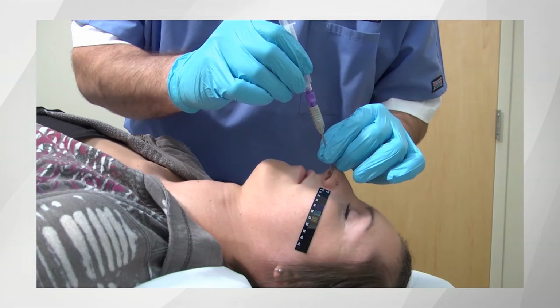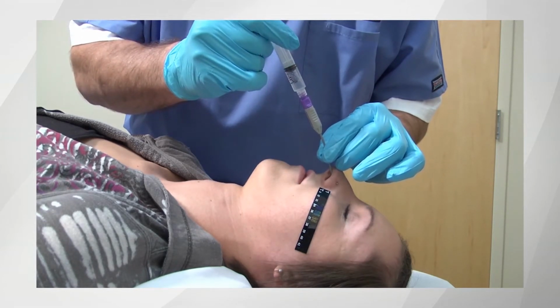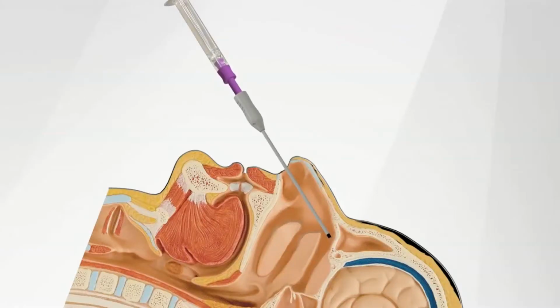This will allow the practitioner to adjust the position of the outer sheath held between the thumb and forefinger while the inner catheter is advanced. The inner catheter is then advanced into the extended position by pushing on the purple hub with a gentle, equidistant push-pull motion to keep the inner catheter directed above the middle turbinate. During deployment of the inner catheter, it is important to move the gray hub and purple hub simultaneously in an equal distance towards each other.